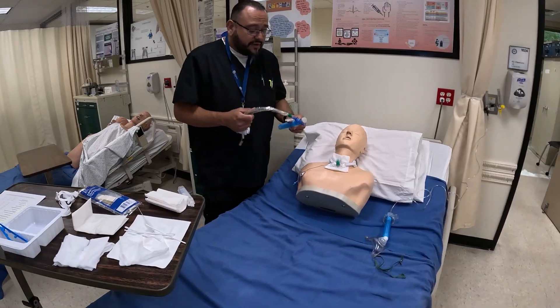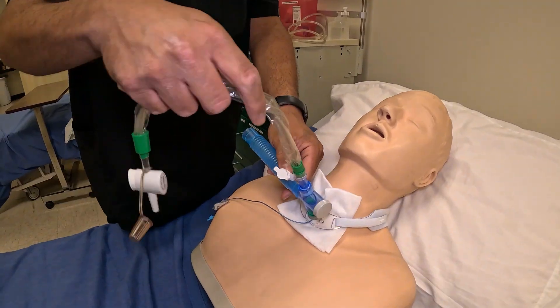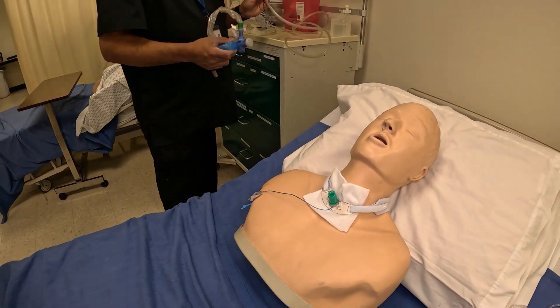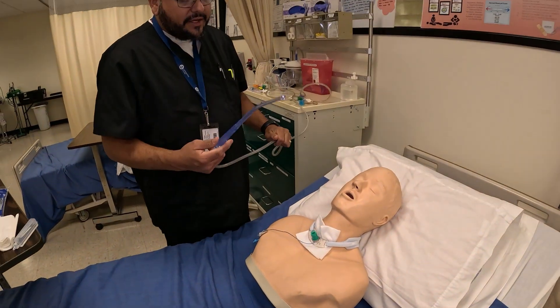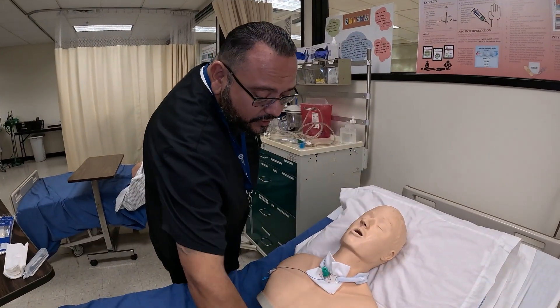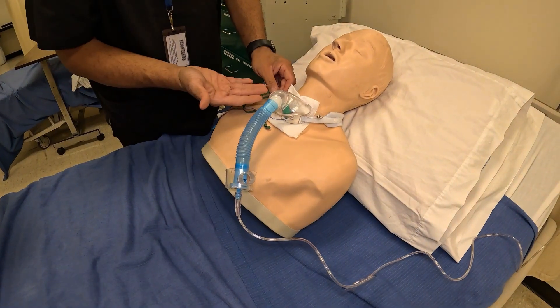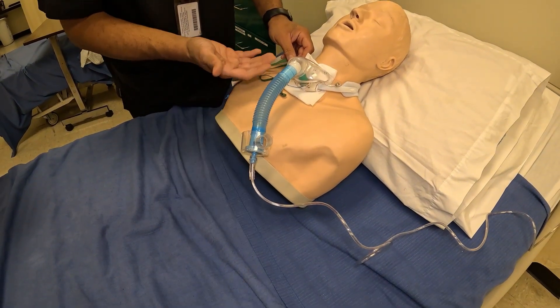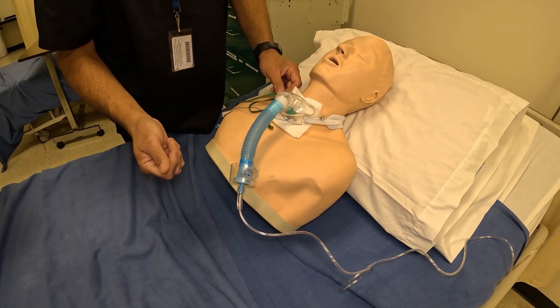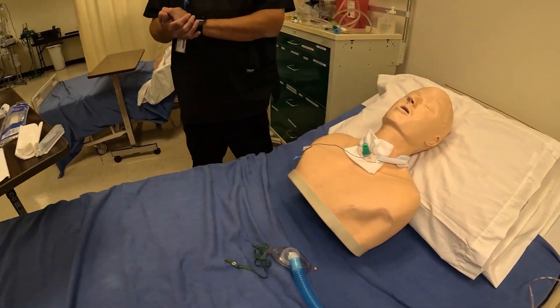I'm going to have suction equipment on standby just in case. I have a Ballard — a trache Ballard — hooked up to suction tubing if I need to suction the trach. If I need to suction orally, I have my Yankauer ready too. I also have supplemental oxygen in case my patient needs a break: a trach collar with a venti setup running at two liters, 24%.